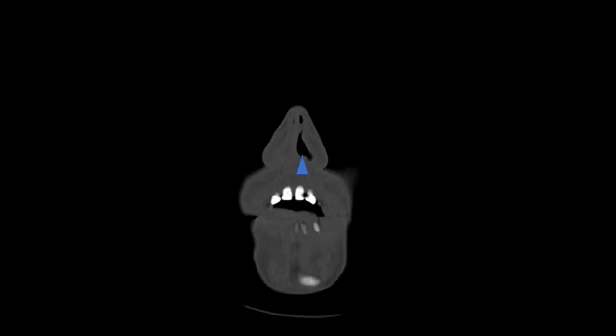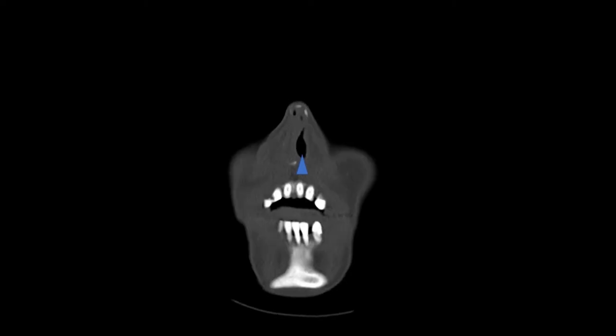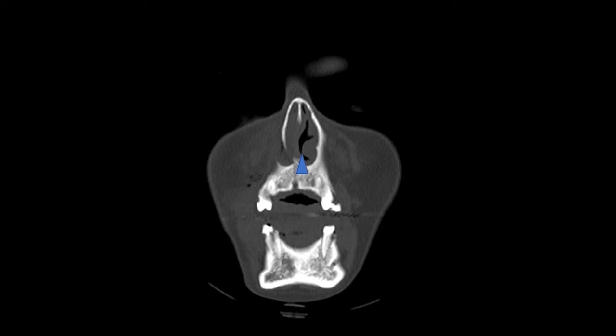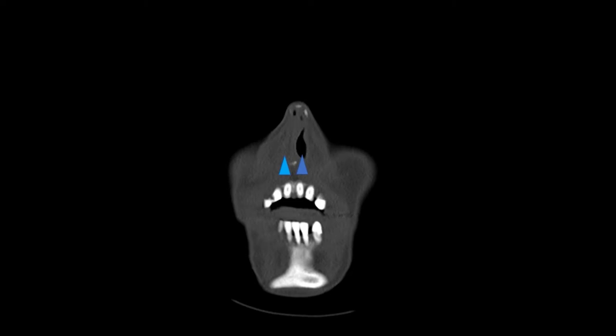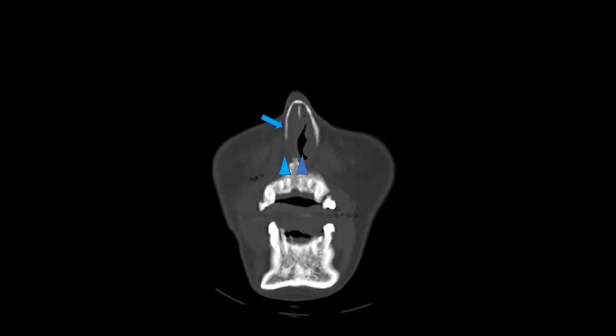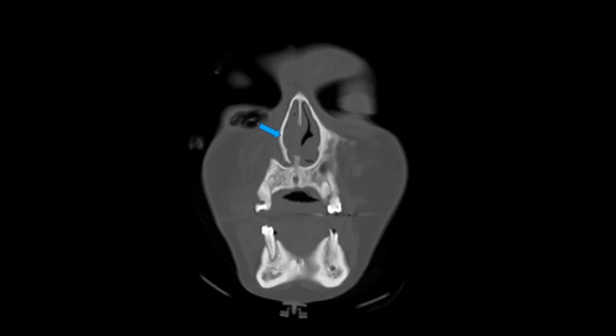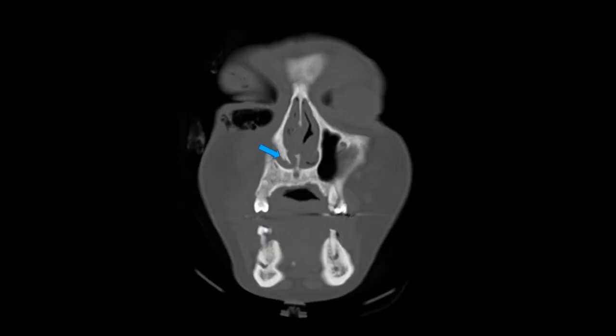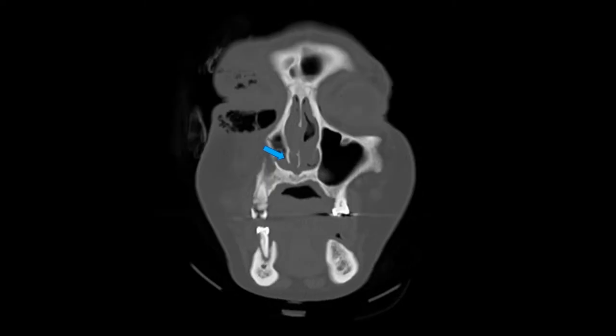Next we'll look at the midline structures. Looking at the nasal airway, here is the left nasal airway highlighted in the blue triangle, showing that it is quite open anteriorly. Here is the inferior turbinate and septum coming into view. You can see the right nasal airway highlighted in the lighter blue. As you scroll back, the right lateral nasal wall has completely collapsed, as the medial buttress is essentially inside the right nasal airway. This is resulting in severe nasal airway obstruction on the right side.